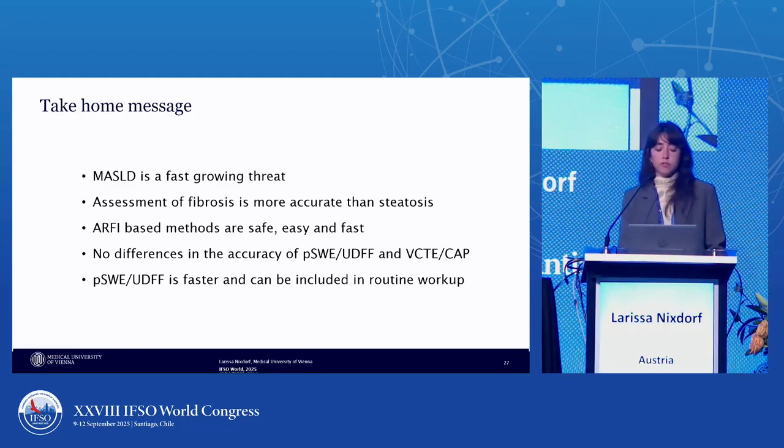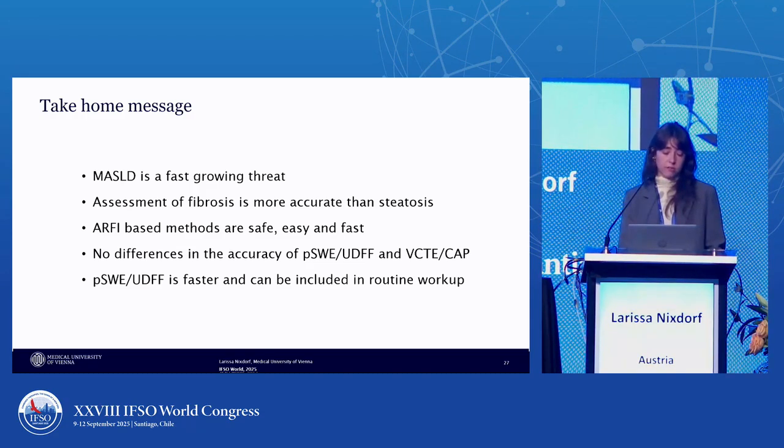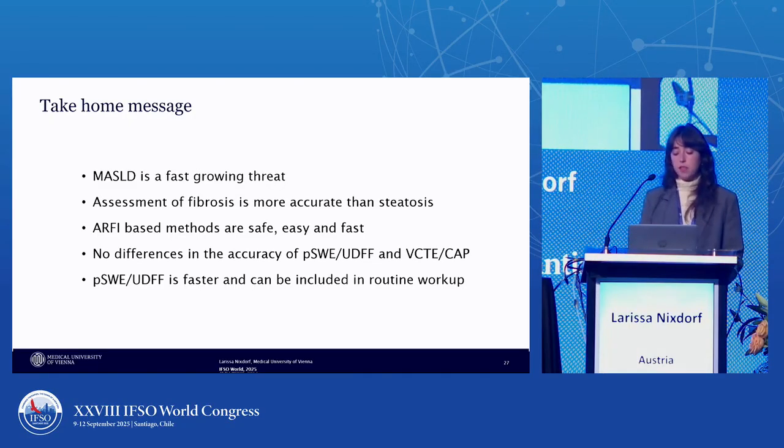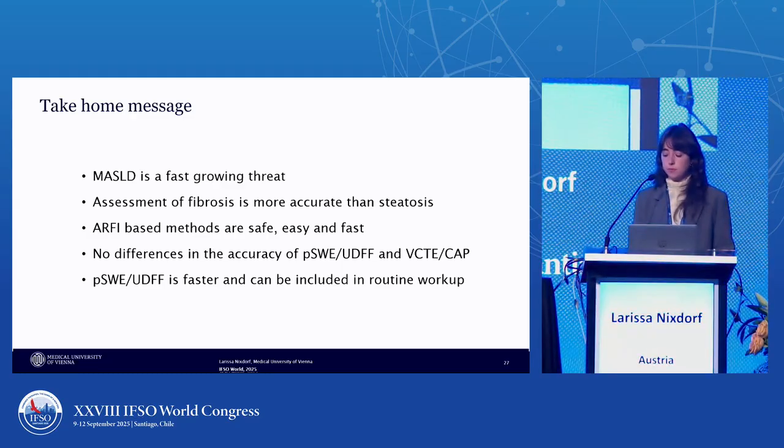We had no differences in the accuracy of point shear wave elastography and VCTE, or ultrasound-derived fat fraction and CAP. But the newly developed methods are faster, and they can be included in your routine workup, so in every ultrasound exam that you do with your patients.